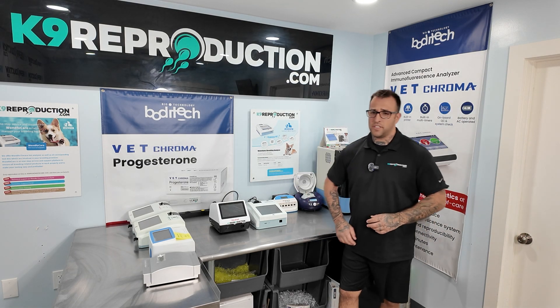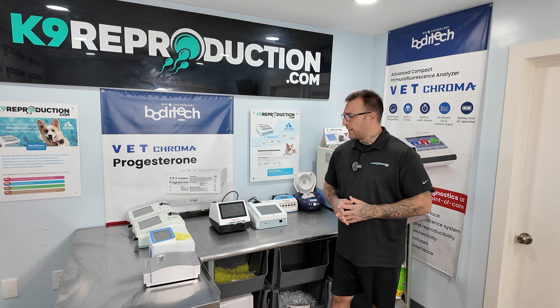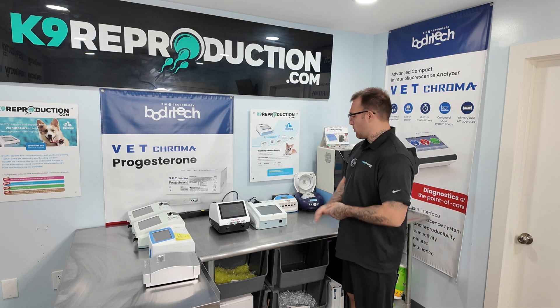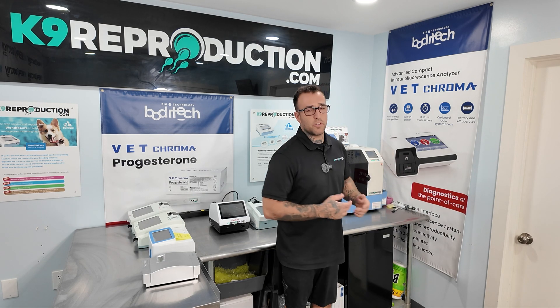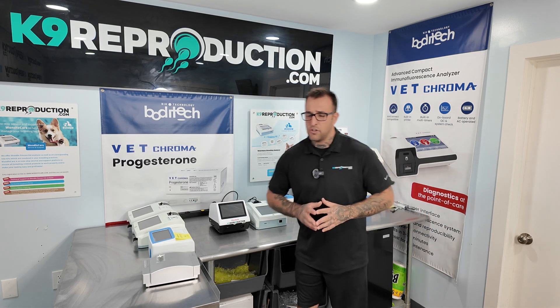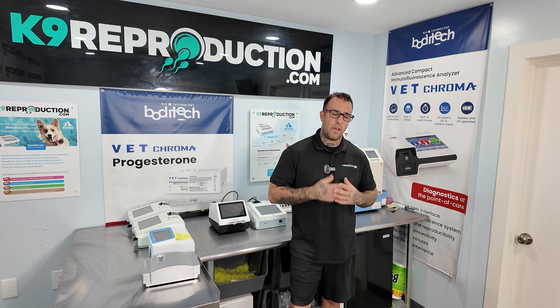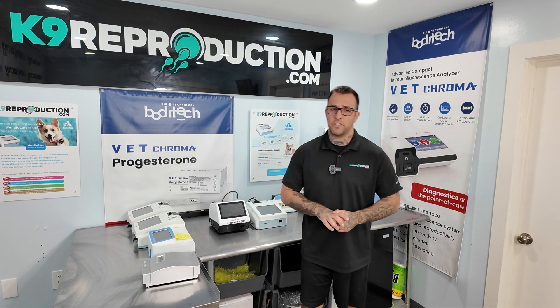Each of these machines is fundamentally different. While they all perform canine progesterone testing, the Heel Vet operates on a 0 to 20 scale, the Wanfo is on a 0 to 50 scale, and the Vet Chroma is on a 0 to 25 scale. Each machine has its own nuances, so when people call asking which machine is best, you really have to understand how they've learned and how they're used to understanding the breeding cycle and which scale they prefer.